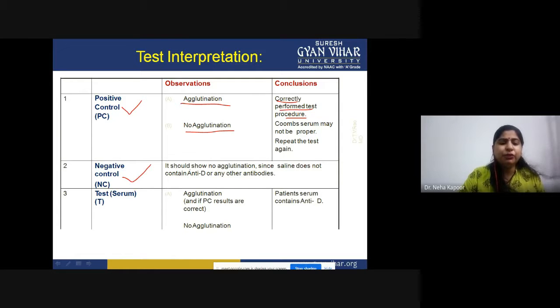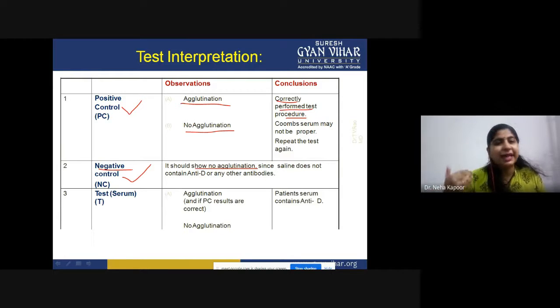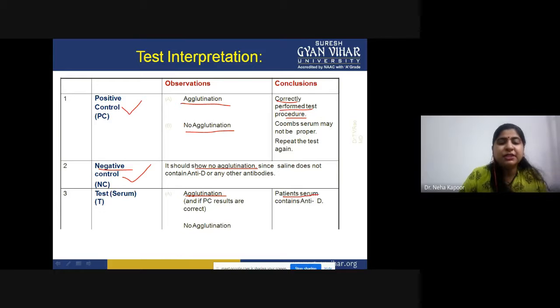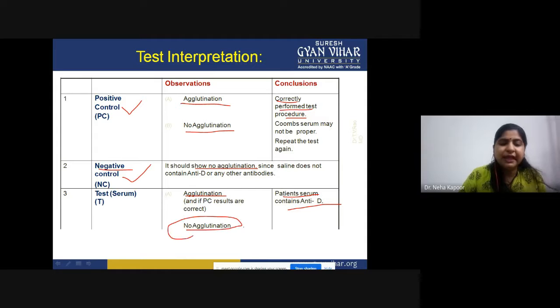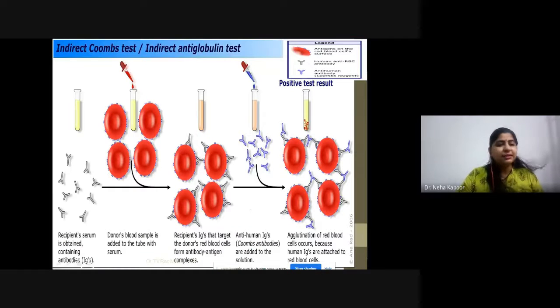In the case of negative control, it will show no agglutination, as the name suggests — because we added saline, which contains no antibodies. For the test tube: if agglutination is present along with positive control also showing agglutination, then the patient serum contains anti-D. If no agglutination is observed, the patient serum does not contain anti-D and there is no presence of auto-antibodies.